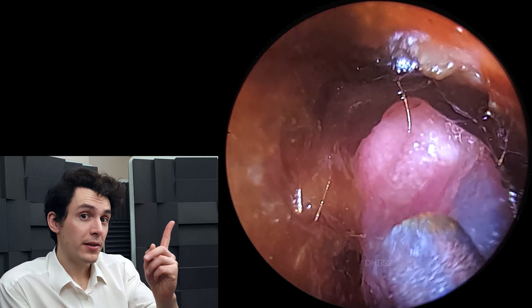This is a rather interesting tool which I don't feature heavily — it's a curved fine end. I thought this would be a good opportunity to use it to hoover up some of this remaining debris, but it's very difficult to use. Applying just a little bit too much pressure here, the patient found that uncomfortable — no bleeding or anything, but you can understand why that curved point can be uncomfortable. So I very rarely use it. It's one of those tools that you have if you need it, but for the most part it's very limited use.